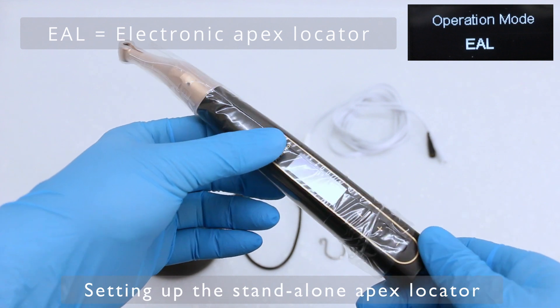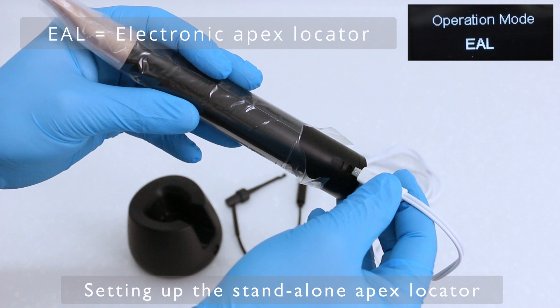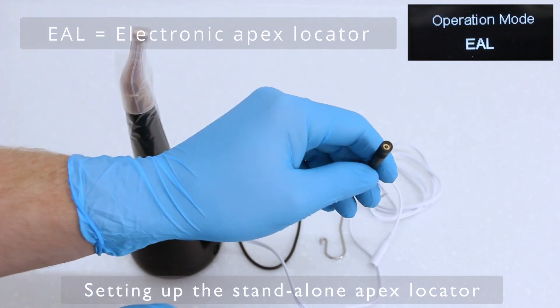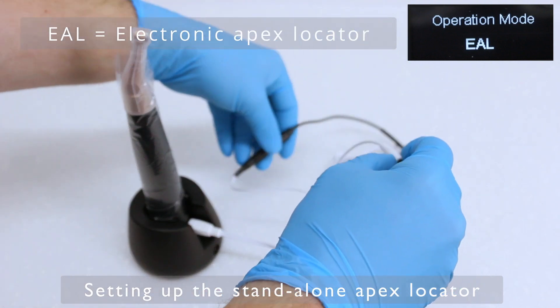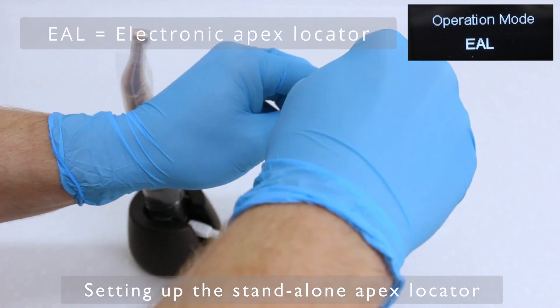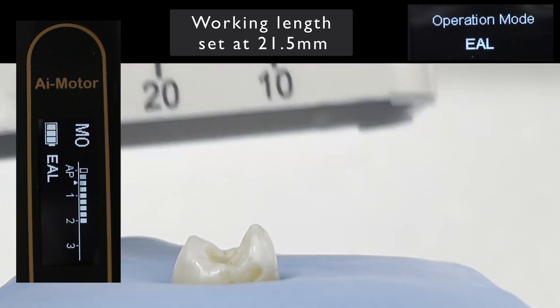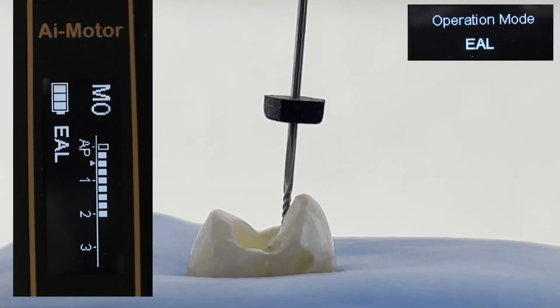Firstly, I'll introduce the Apex Locator. This can be used as a standalone unit or during operation, and the setup is very easy. It's important to note that the removable rubber sleeve ensures the Apex Locator does not short out and provide a false result. It's handy to keep the unit in its base when using this mode, but real care is required if there is a file fixed into the handpiece, as it can be a significant needlestick risk. I've used an extracted tooth placed in Alginate to demonstrate the Apex Locator in action — I really like the OLED display and audible indicator, as they are both quite clear and easy to understand.